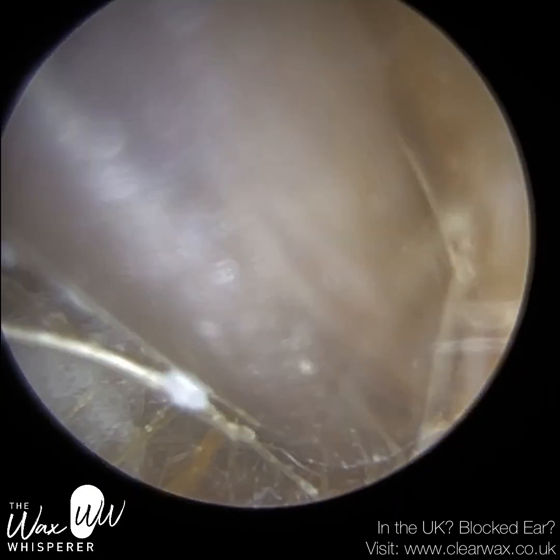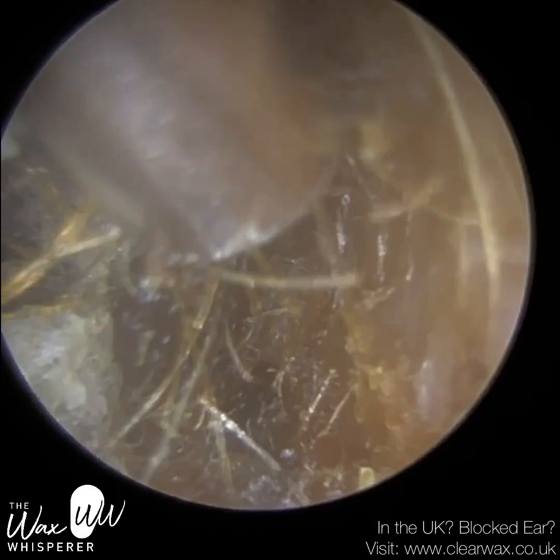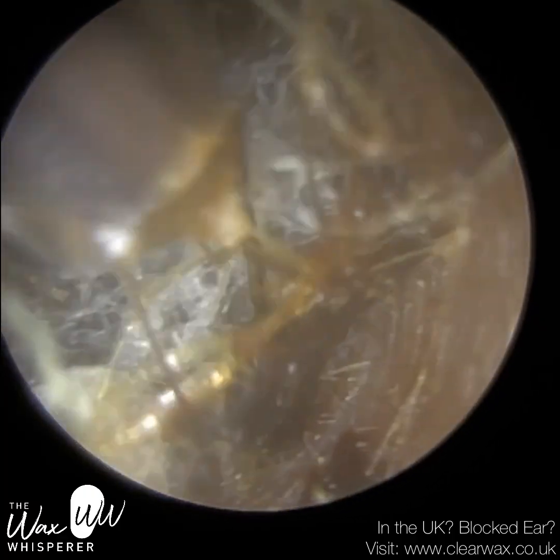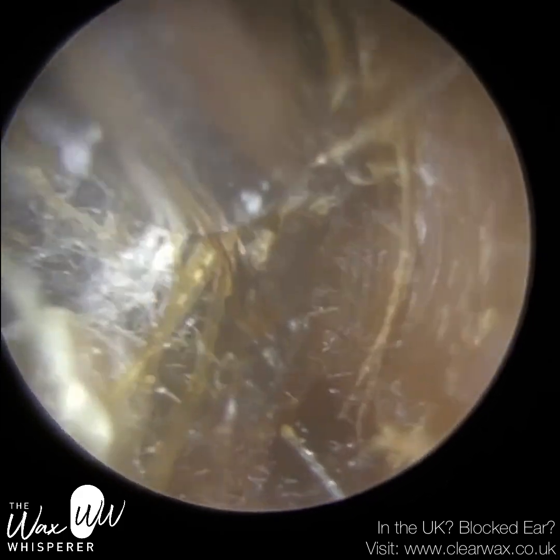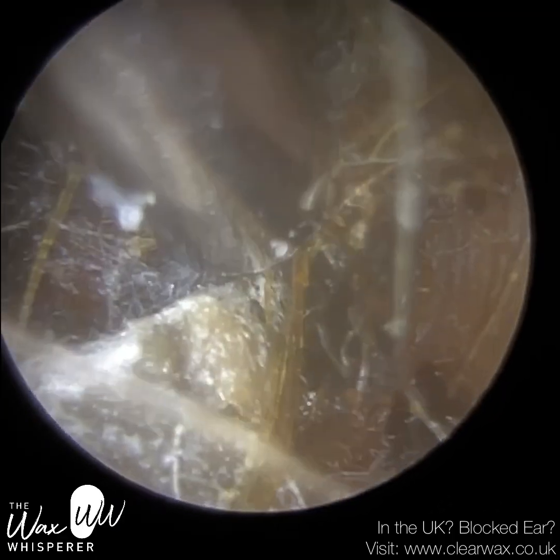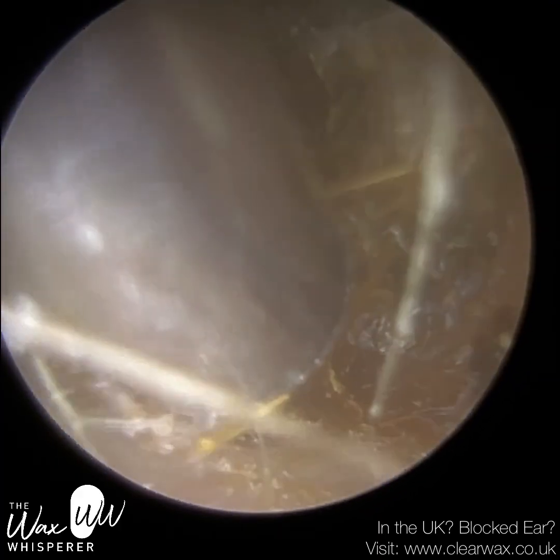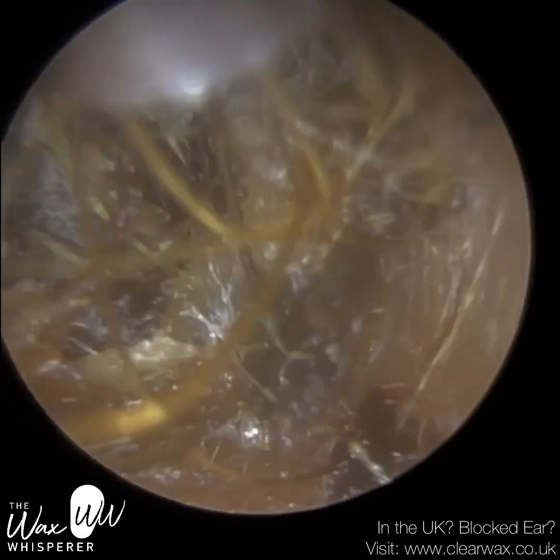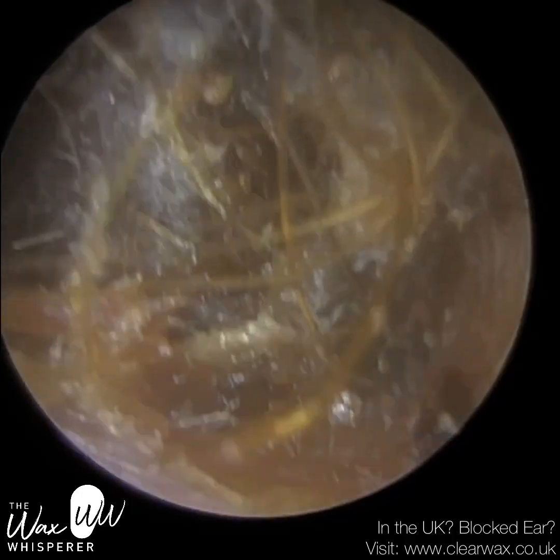The patient didn't actually feel that this ear was blocked. It was only once I showed them the examination clip that they realised. And that's most likely due to the fact that the left ear was so much more blocked, and in comparison to their bad left ear, the right one must have been much better. So that can quite often happen. You have patients who attend just believing they've got earwax in the one ear, which is the really bad ear, and sometimes I would remove that one first, and then only then will they notice that their better ear is actually not as good as they thought it was.